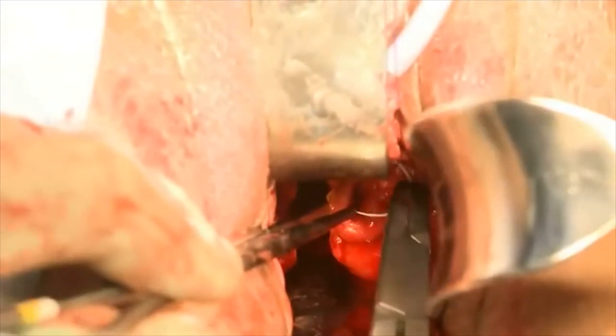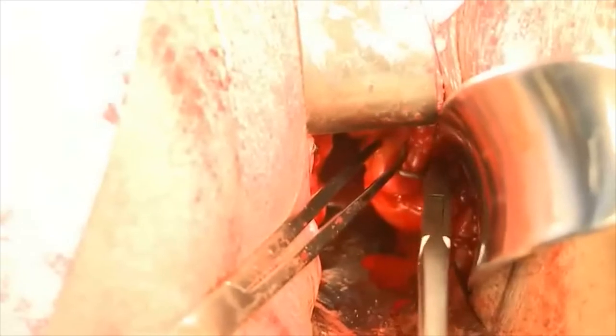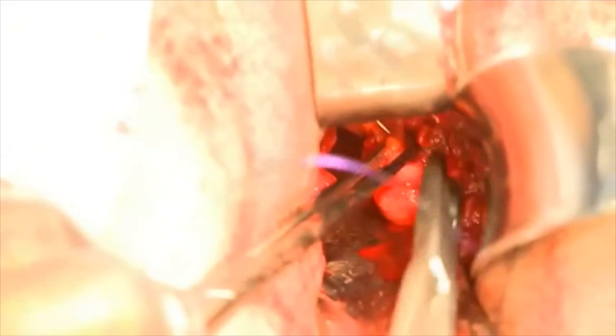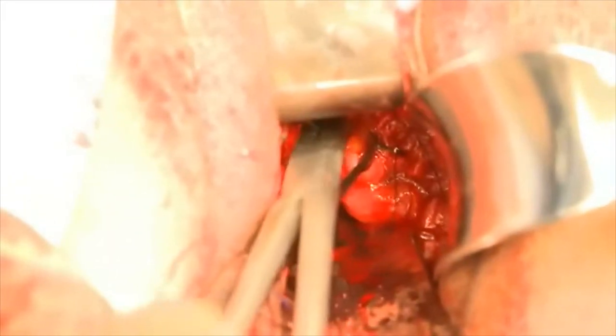Similarly, on the patient's left side, we're going through the most distal suture through the full thickness of the utero-sacral ligament in a figure of eight fashion, and then the most proximal suture is the closest to the sacrum.